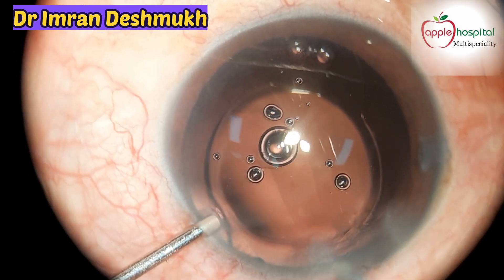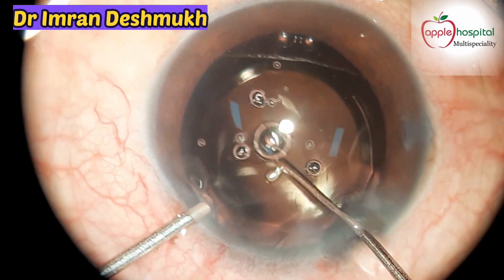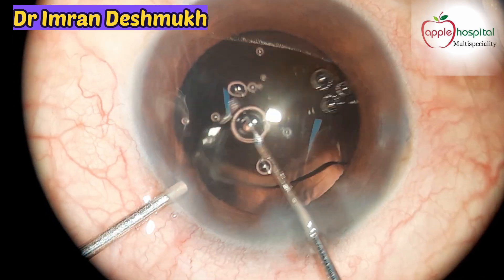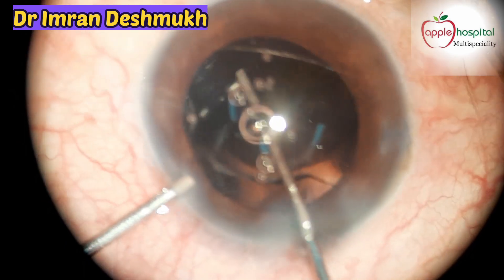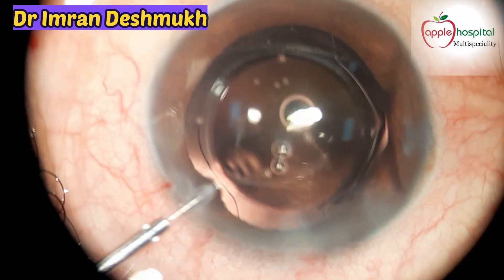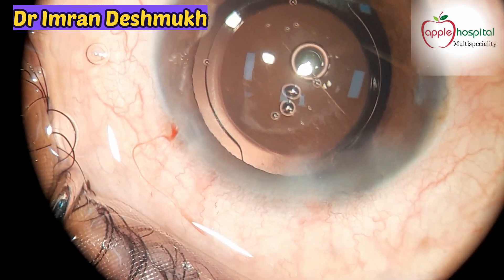The trailing haptic is in the sulcus. You can use any instrument — I use a T-pusher to push the IOL into the bag. That's nice — a well-centered IOL in the bag. That looks clean, that looks neat.